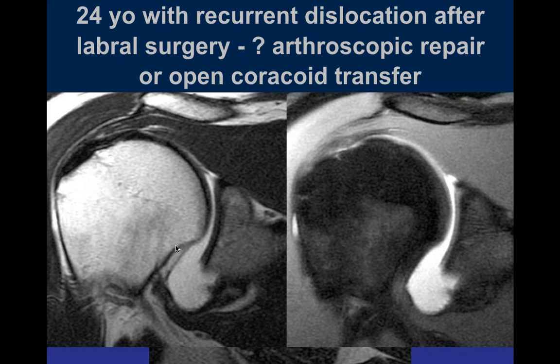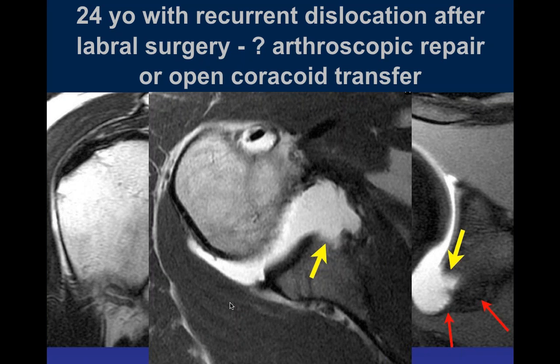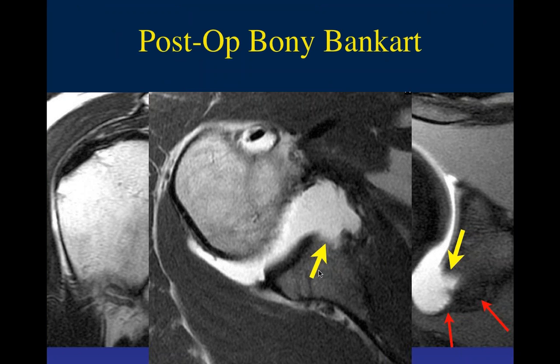And also, there's a lot of attenuation of the capsule and inferior glenohumeral ligament origin from the humerus, or attachment to the humerus. But here, this is a displaced inferior labrum and capsular attachment. And there you can see where it should be. Here are the axial images where we can see the big defect and displacement here. So this is a bony Bankart after surgery.